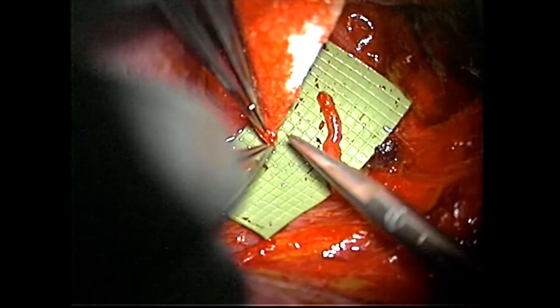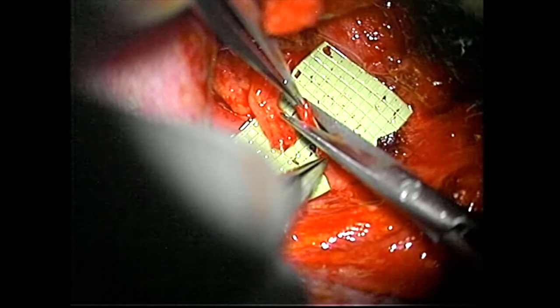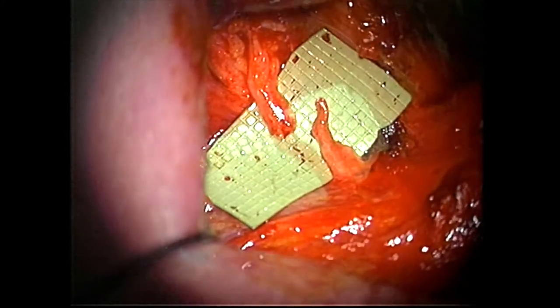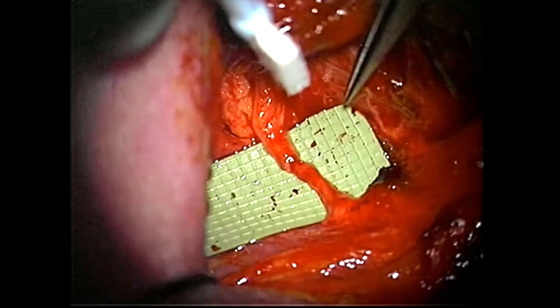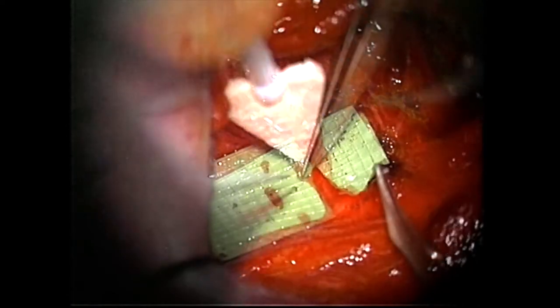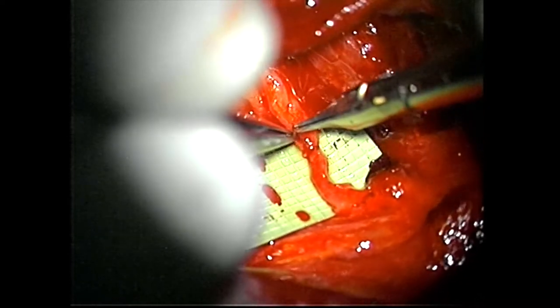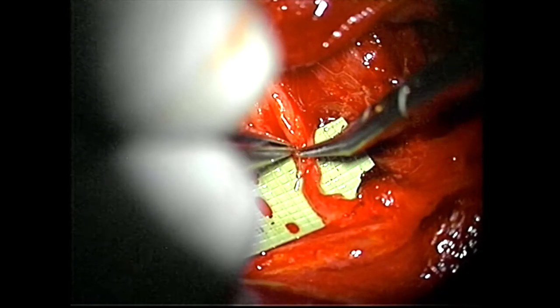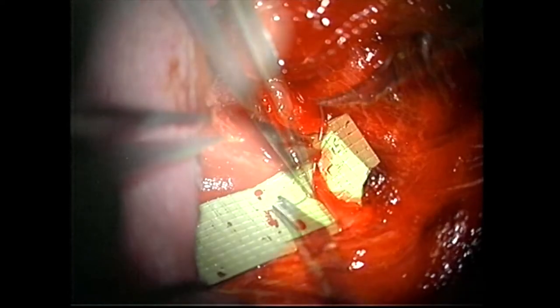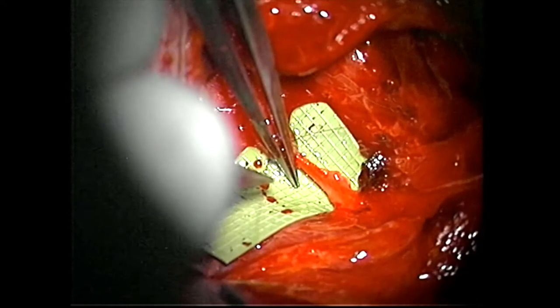Working on the end of that recurrent nerve. Now we transition over to the ansa cervicalis and freshen up that edge — a nice transection there. It's typically a fairly good size match; this one the recurrent is a bit larger, but that may just be because there's a bit more fascia around it. You take your 8-0 suture, typically 8-0 or 9-0, and start taking small bites into the epineurium or even into the fascia. As long as you get this into a nice approximation, you really only need two or three sutures — usually I do three.